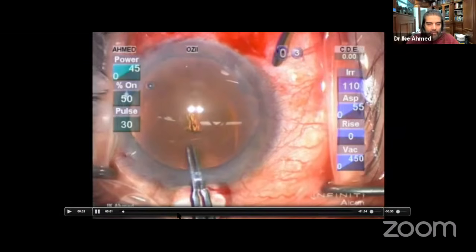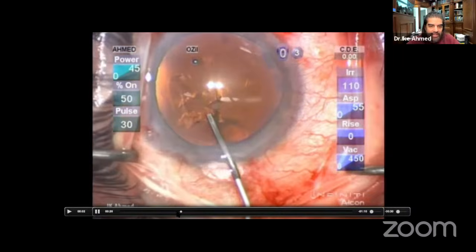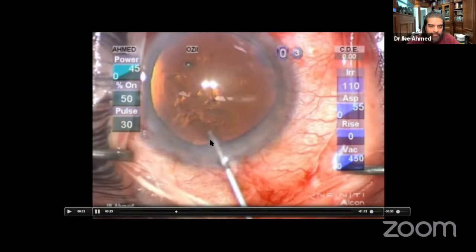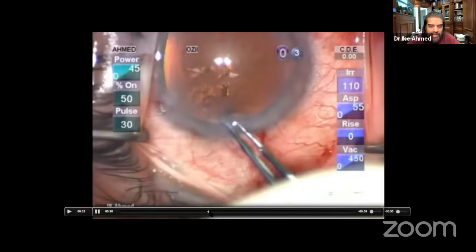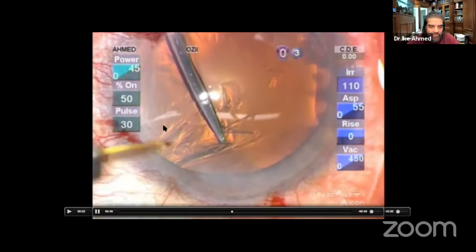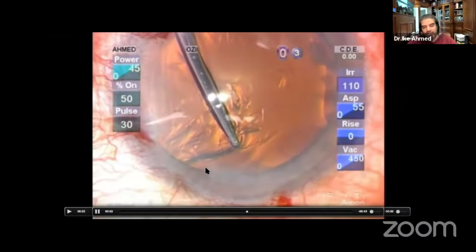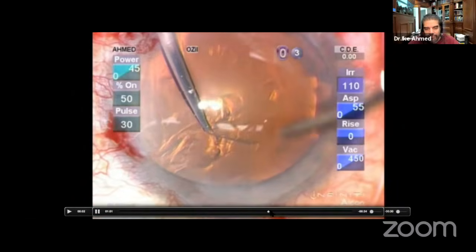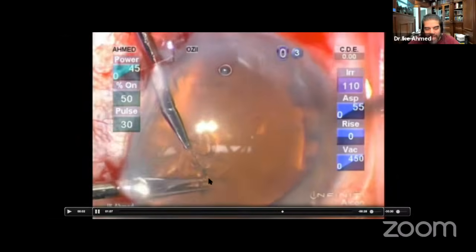This is an example here where the surgeon started the capsulorhexis, and the rexis is running out here. You can see subincisionally, it's really, really far in the periphery here. And so the surgeon had to stop and then cut. Look how far it's run out, really far out into the periphery here. So sometimes making another incision and using a pair of micro scissors can be used to amputate the flap. And here we're basically cutting with the scissors and amputating the flap where it's run out. And so you have a discontinuous capsulorhexis.